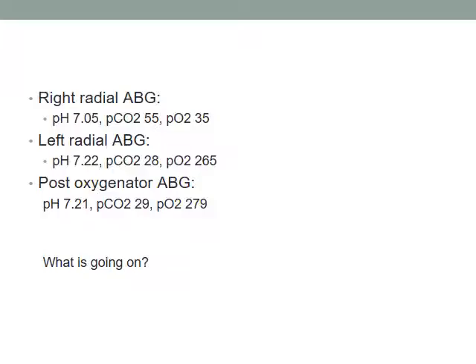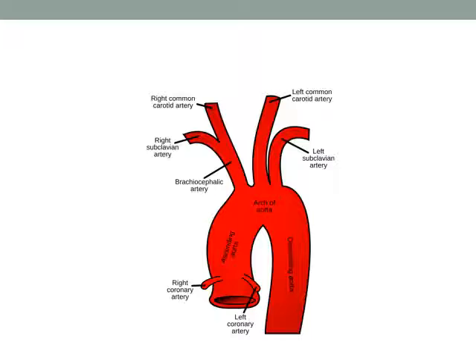So, and just to show you again there, bad lungs pumping out blue blood, bathing the coronaries, coming out here, right radial, then we got red blood coming up the aorta and getting the left arm, and then somewhere between here and there, we don't know where, is the break point. But we have falling cerebral oximetry, so at least one, if not both, carotids aren't doing well. So we've got to do something here.